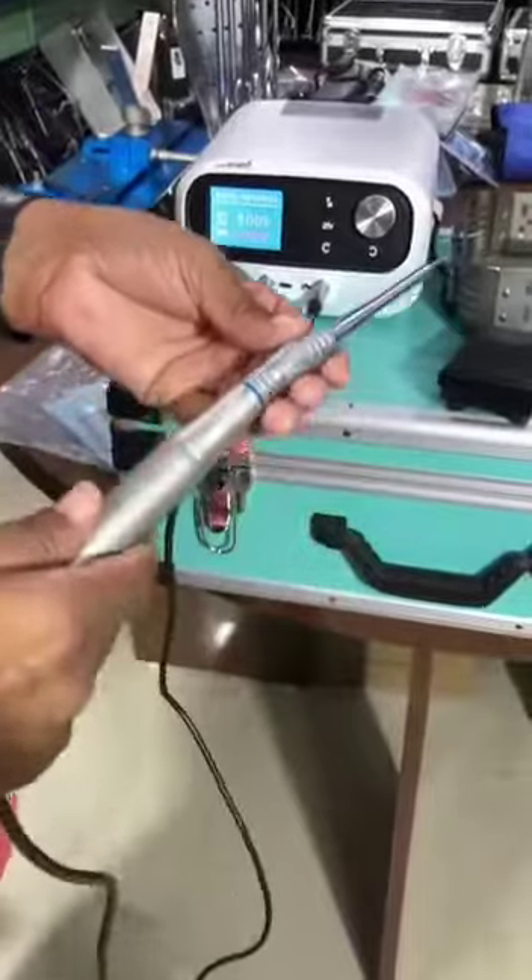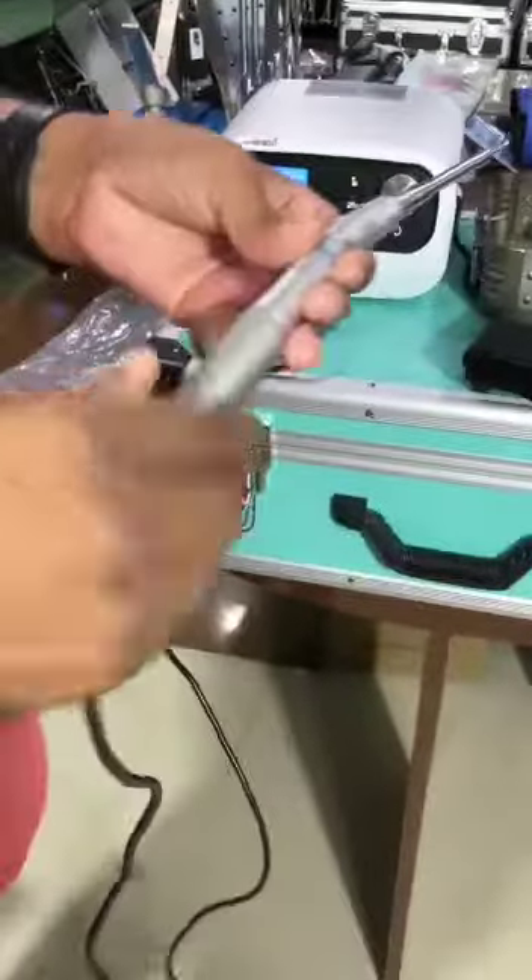No vibration, nothing. It's the most useful thing for the spine.